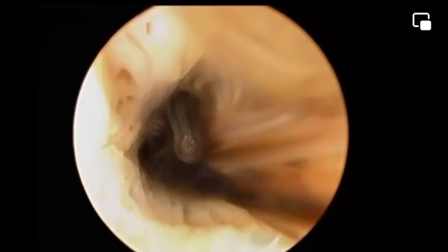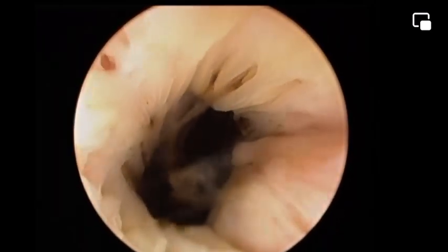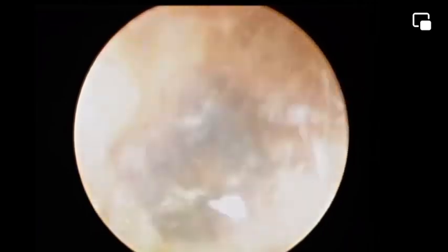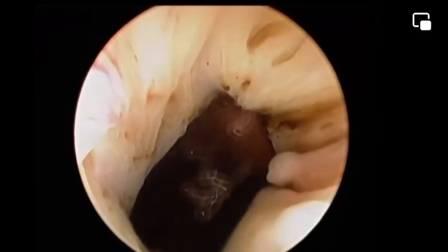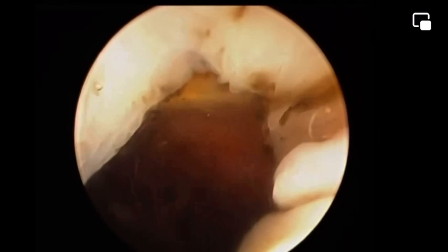And in my opinion, this is the pathogenesis of the ismocele, which causes pain, infertility, continuous bleeding, because the mucus and blood collect in this pouch and continuously dribble and trickle all through the months, causing this troublesome, awkward, irregular bleeding. And definitely it is like an obstacle for the sperm migration or going through the cervical canal to the cavity. Look at this. All this viscid, dirty mucus and blood was actually in the cesarean scar pouch or defect. Let's go in and see more pathology.